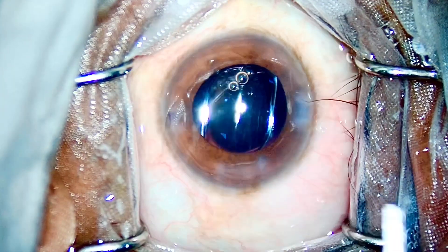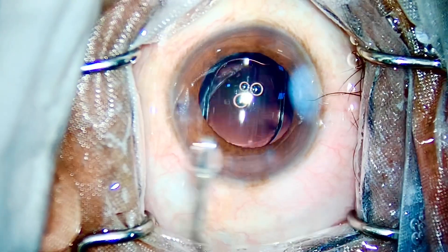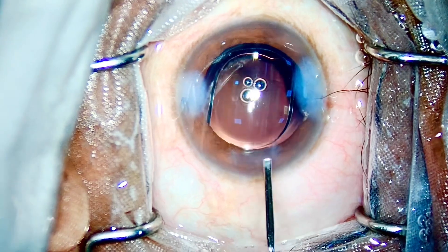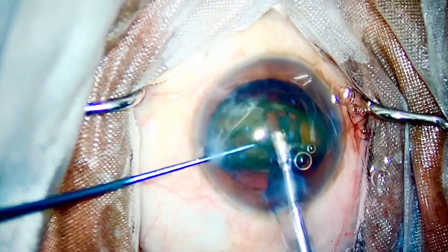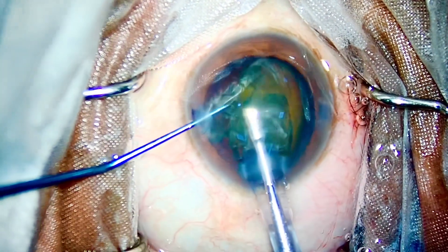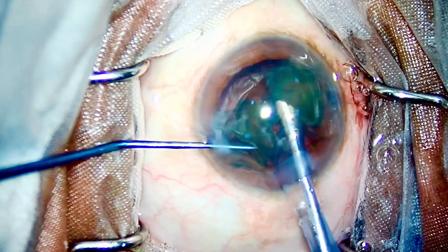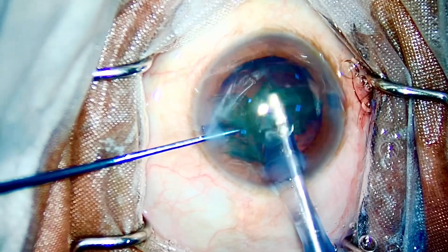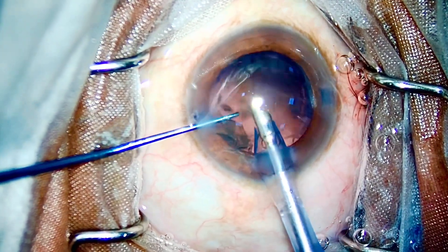Try it in some of your patients that are grade 1 or grade 2, and especially in diabetic patients where you get stuck in initial days — trenching and sculpting won't work in these cases. The chopper goes through and through, there is cheese wiring, which raises the rates of complication. Once again I will show you the move: I am at the junction of endo and cortex, phaco 3, phaco 2 — and just one rotation. If you manage a single rotation of the nucleus, it will debulk the nucleus to a great extent, and the rest of the pieces just follow in because of your flow rate.